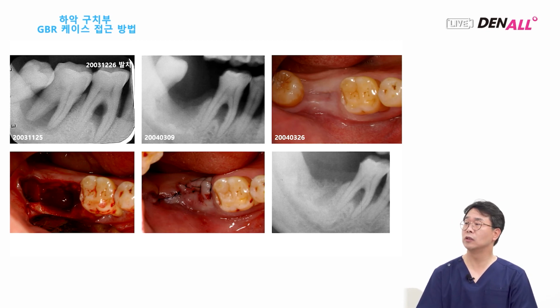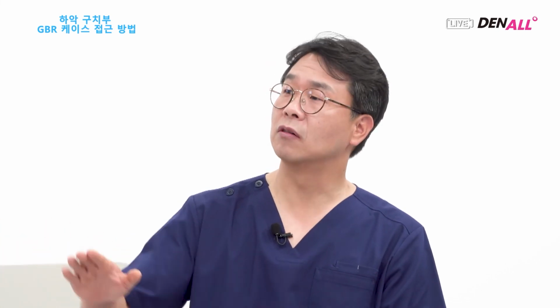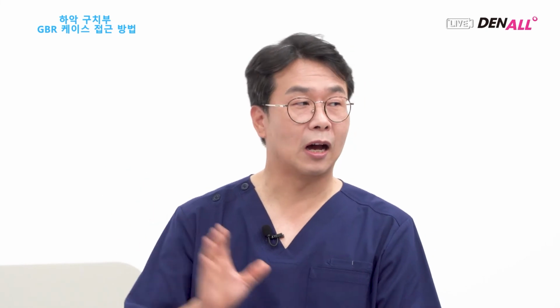These days, the alveolar ridge preservation technique is available, but at that time, it was not widely used. As you said before, a simultaneous approach is used now, but at that time, a staged approach was used primarily.